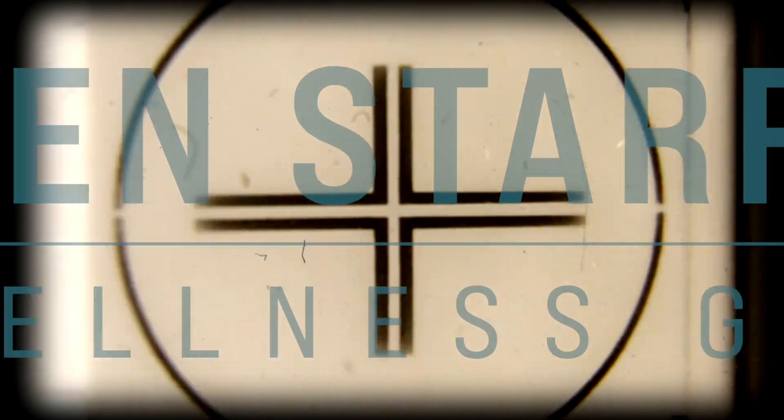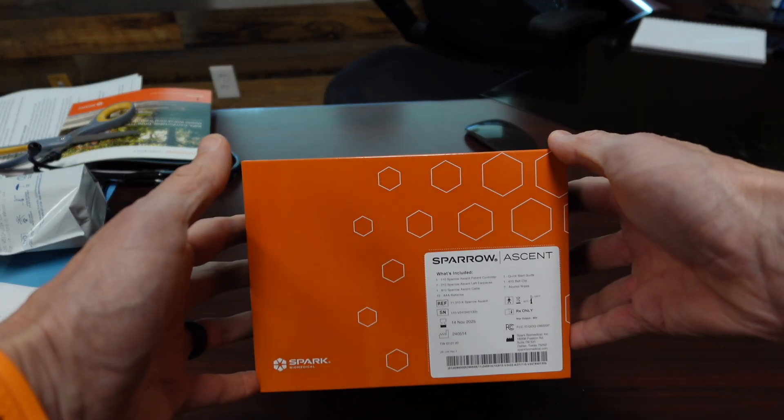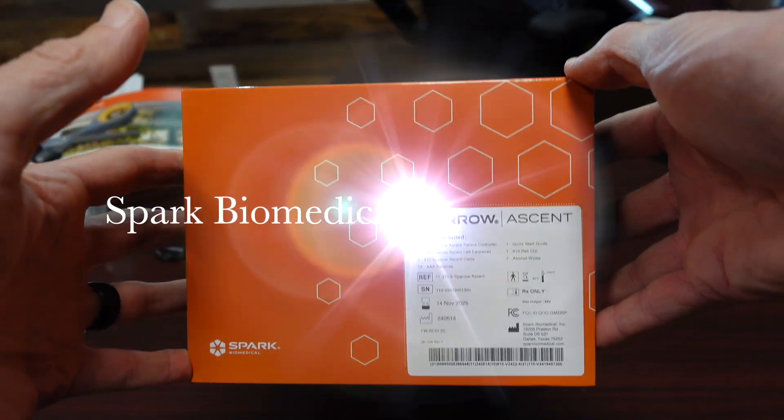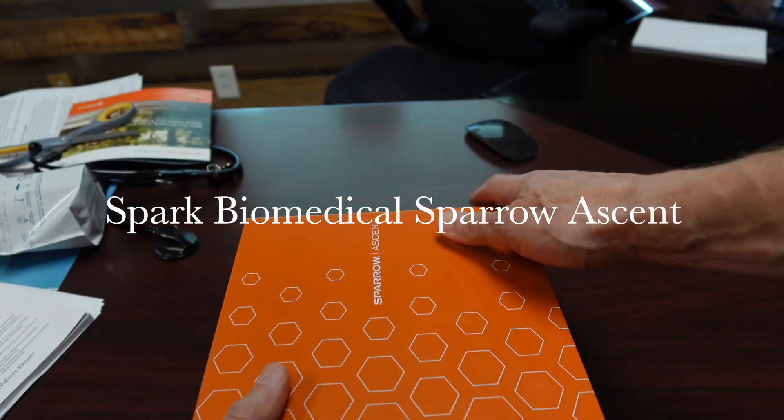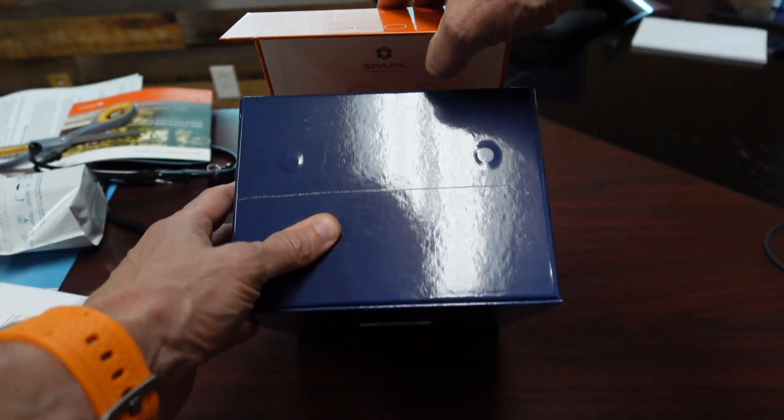Hey, it's Dr. Ken Starr with the Wellness Group in Rio Grande. I'm going to show you today the Sparrow Ascent device by Spark Biomedical. Spark Biomedical makes this a transcutaneous stimulator, FDA approved for opiate withdrawal.